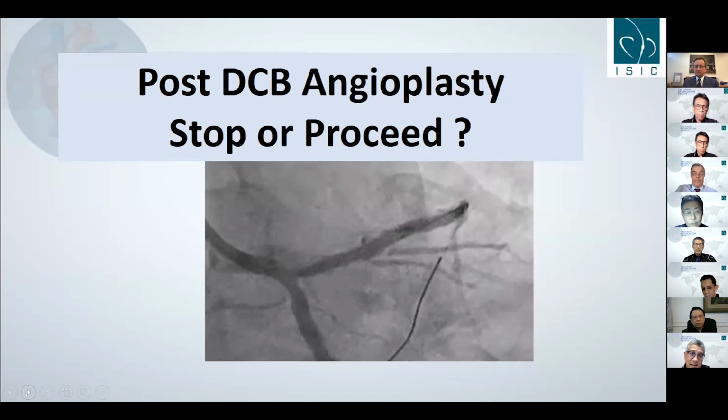And I really agree with Dr. Kinoshita that we must do another OCT run and see what has happened. And in terms of your strategy, I still think that the two-stent strategy is unavoidable in this kind of situation. That's all, Laura. Thank you so much.